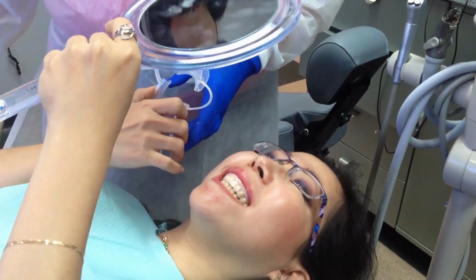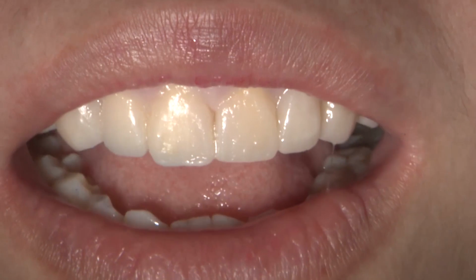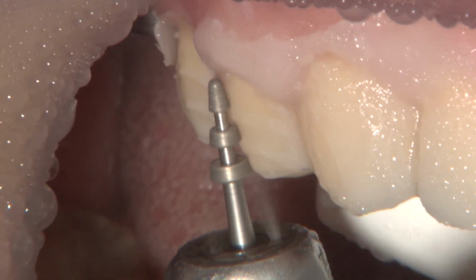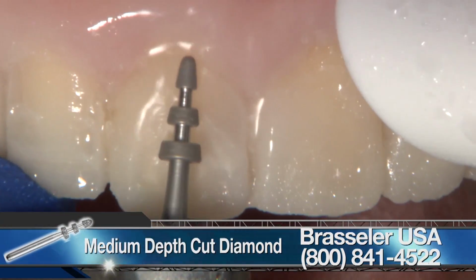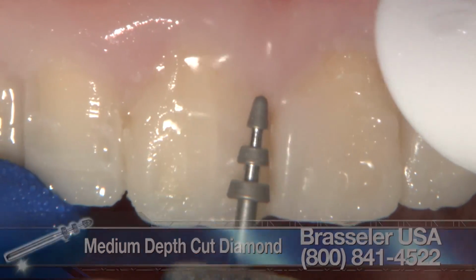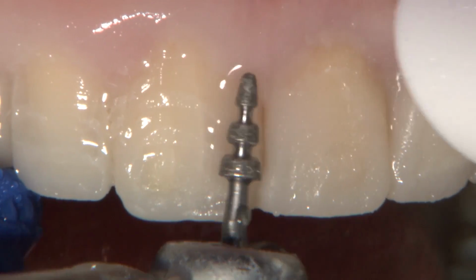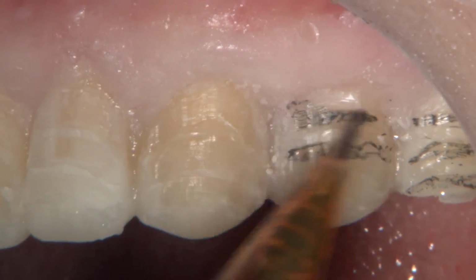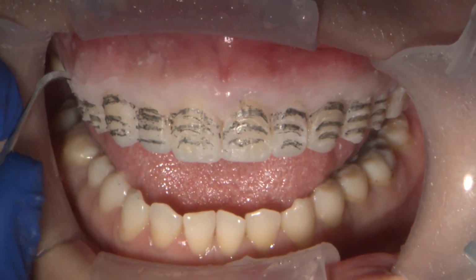After the gingiva was allowed to heal from the surgery, another pre-evaluating set of temporaries was used that took into consideration the gingival repositioning. I used this set to place facial depth cuts. Here I use a depth cut burr from Brasseler USA that provided a 0.3 mm depth gingivally, 0.5 mm at the middle third, and 0.7 mm incisally, providing a preparation that follows the 3 different planes. Once I was done with the depth cut, I marked the horizontal grooves with a pencil and used the curette to flick the matrix off.